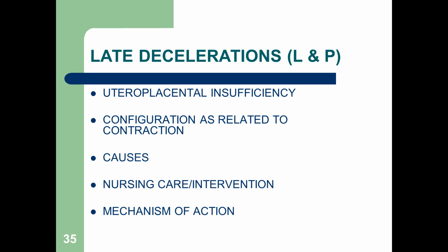Causes of late decels are usually maternal hypotension or hypertension, diabetes, but all of those conditions lead to placental insufficiency. So you've got a problem. It's due to the placental insufficiency, okay?